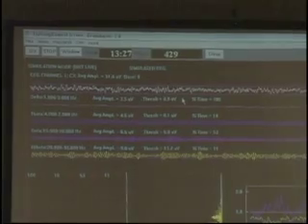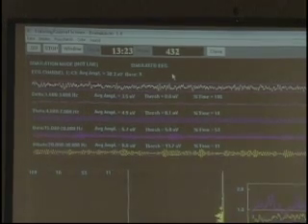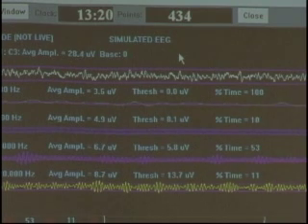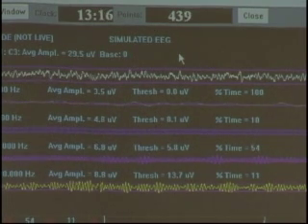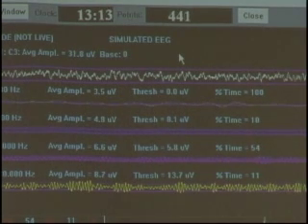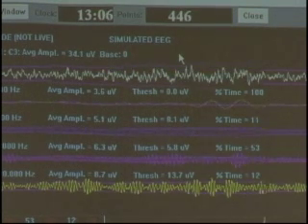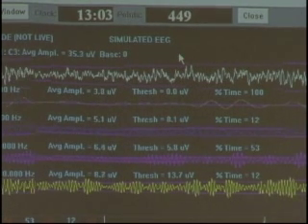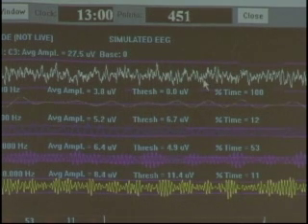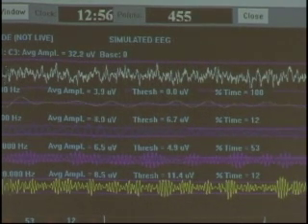Now what if I want to look at the raw waveform but it's too small? I just want to zoom in — I'm not changing the size or the power, I'm just visually zooming in. On a desktop it's just the plus sign; on a laptop you have to go Shift+Plus or Shift+Equal to increase the size. Do you see that? Now it's bigger. If I want to take it back down, I hit the minus key.